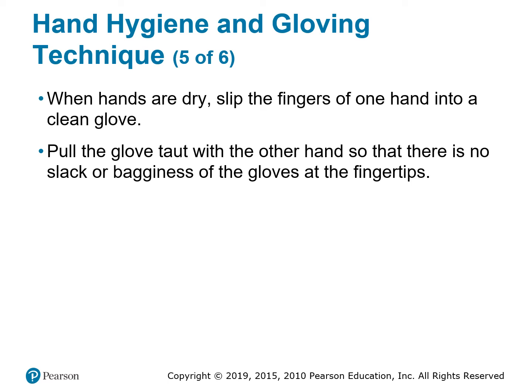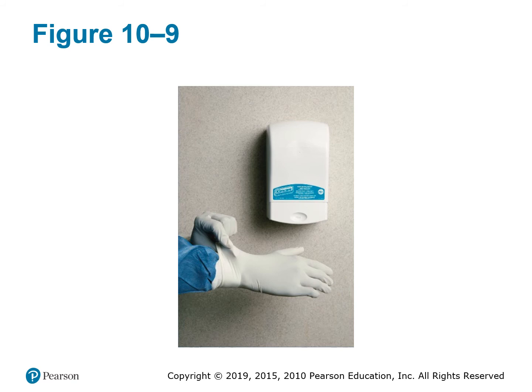So when you have too much play in your gloves, it makes it hard for you to tie the tourniquet, because every time you tie the tourniquet, guess what's going to happen? You're going to lose the glove in the tourniquet. Your finger's going to get stuck in that tourniquet every time, the fingertip. And then guess what else happens? When you go to pull it out, it's going to make the tourniquet roll and you might lose the tip of your glove. So now you got to put on a new pair of gloves. You got to start all over again. So there's different aspects of it.